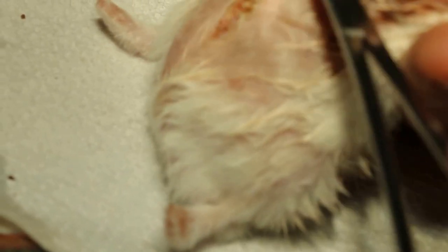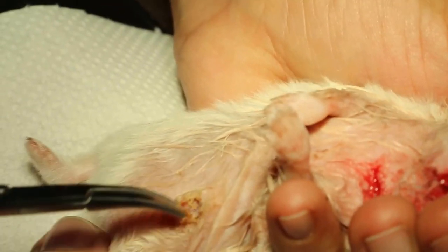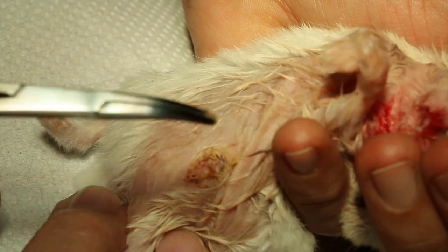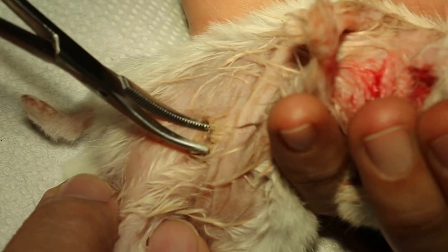This lump is about two millimeters. Always clean up the area here, and this scent gland as well. This scent gland actually contains — just clean up there. It's like a belly button. Just clean up the belly button here. This hamster is really weak; normally they are not so weak as that. It's called a scent gland here.